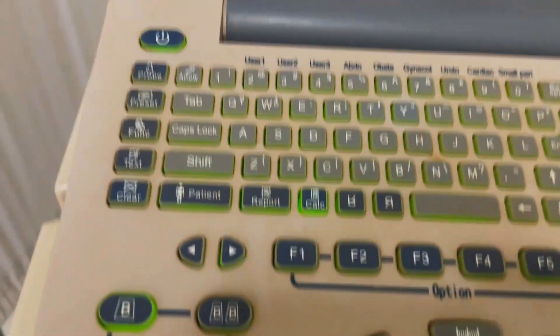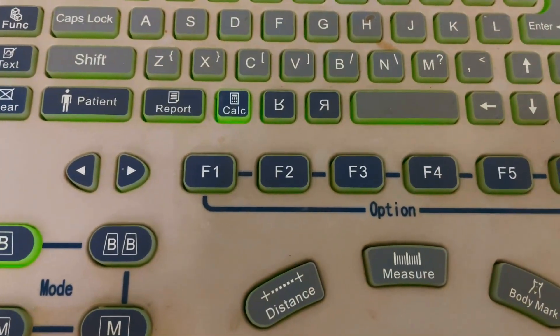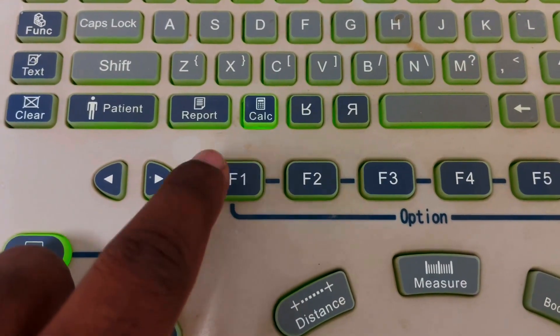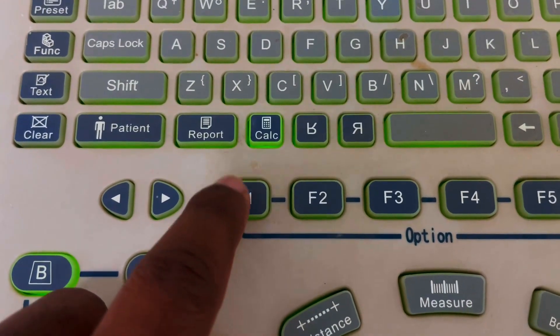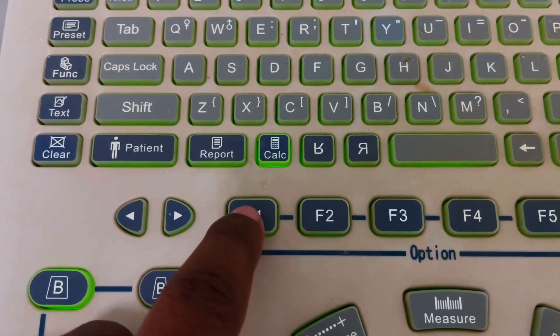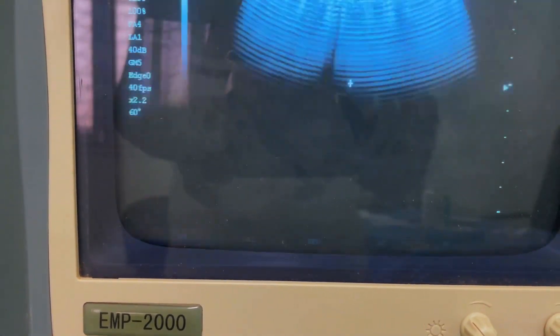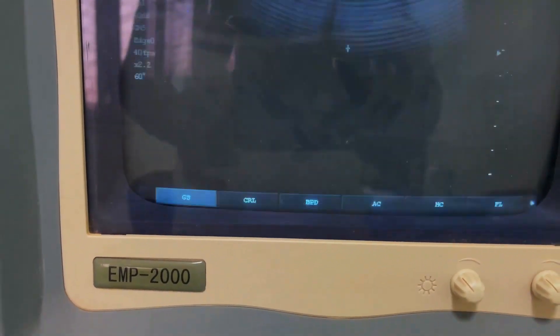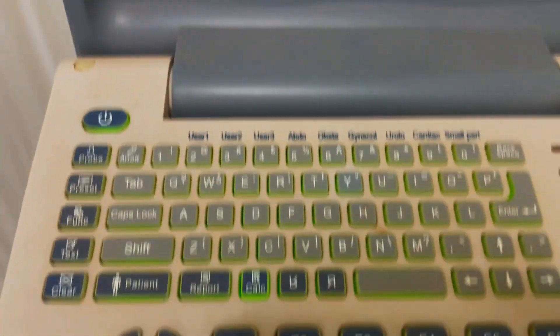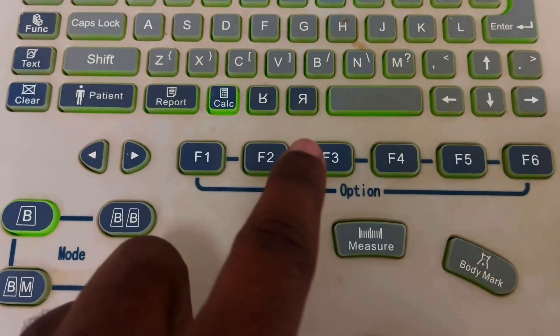Now to select a specific parameter, press F1 to select the first one. Press F1 and see on the screen — your first parameter is selected. You can select other parameters numerically by pressing F2, F3, F4, F5, and F6.